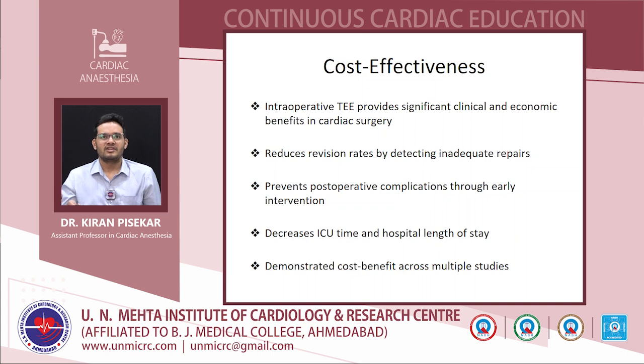It reduces the revision rates by detecting inadequate repair, prevents post-operative complications through early interventions, and decreases the ICU time and hospital length of stay. In our patient, the ICU time would have been increased if we had not repaired the VSD at that time. So it has an extra burden on the hospital and society.